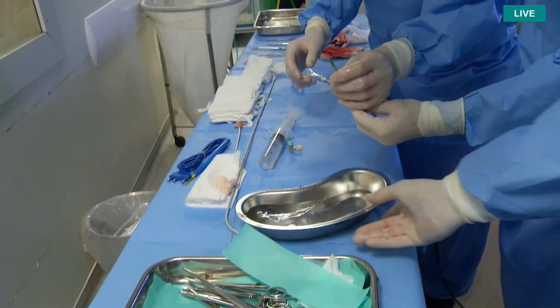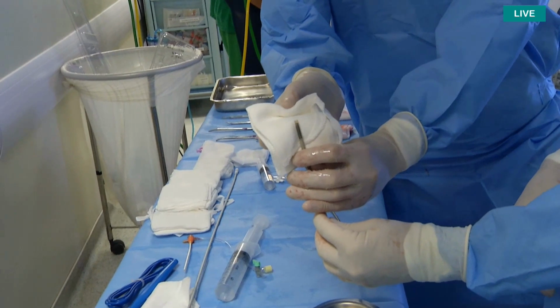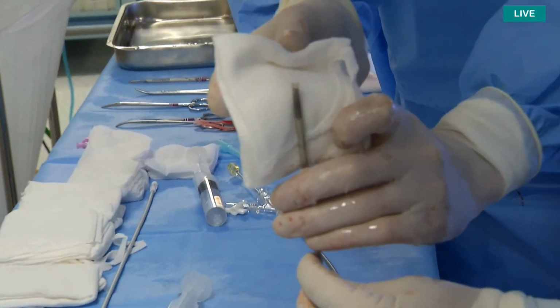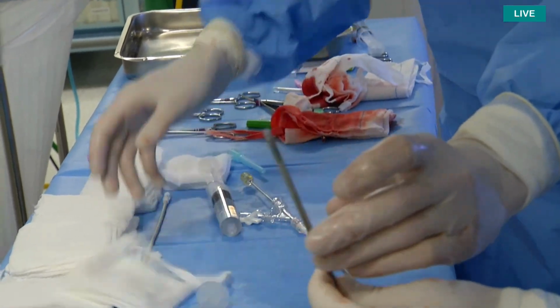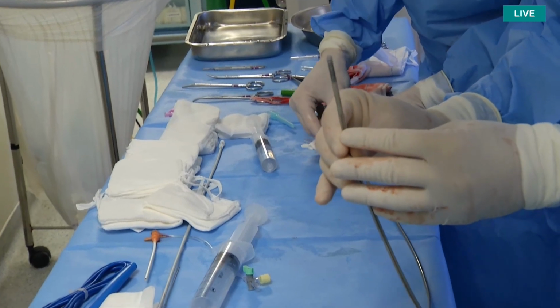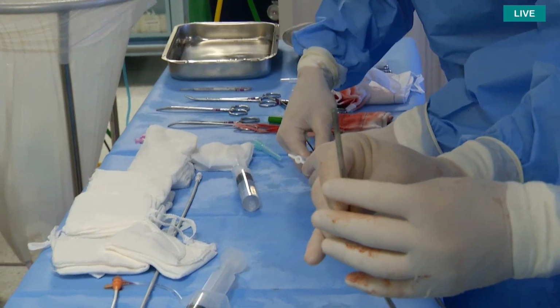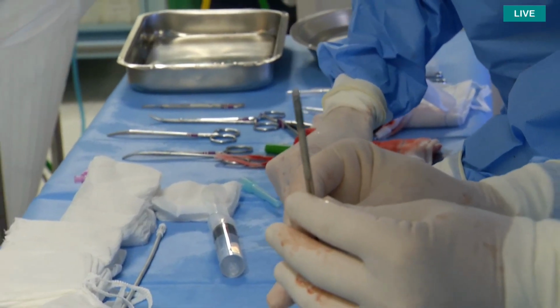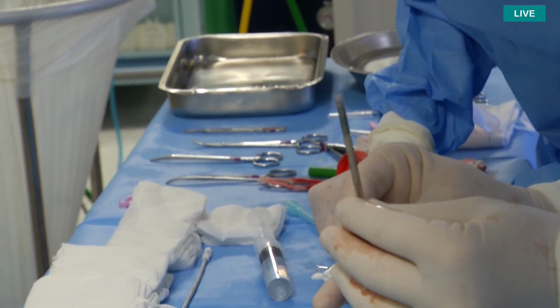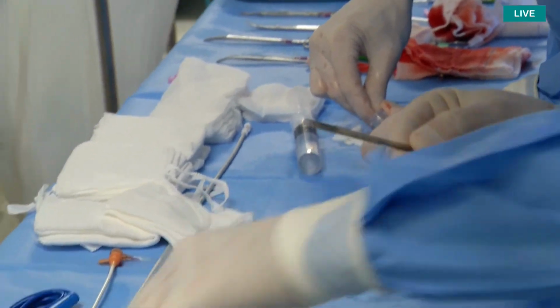It's important to check that the device is really to the ring. I don't know if you can film that, but the device should sit all the way to the radiopaque ring marker. So we check that. And I can even pull a little bit back on the device. Wait a second. Yeah, now I'm pulling back. Not too much. Yeah, there. Let me check a little bit more, maybe.